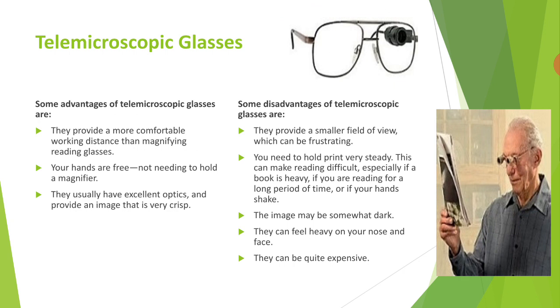Last one for near, we have telemicroscopic glasses. Telemicroscopic glasses are telescopes that are adapted and made for tasks at near, rather than the distance like most telescopes. They are available in many different designs. Telemicroscopic glasses are strong, high-contrast magnifying reading glasses, which allow a more comfortable working distance when reading, using a computer, seeing sheet music, doing hard work, playing cards, and other tasks.